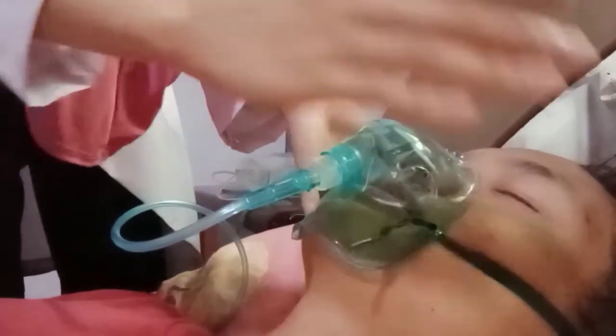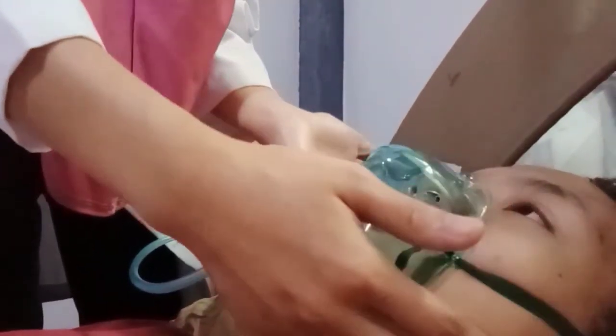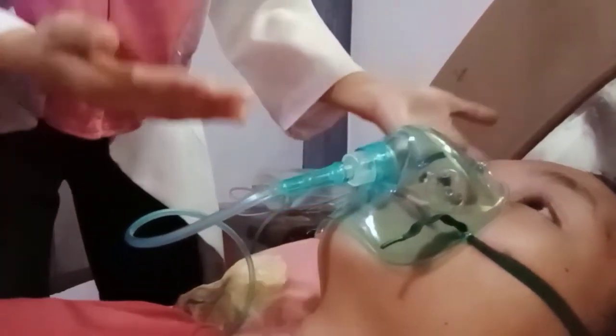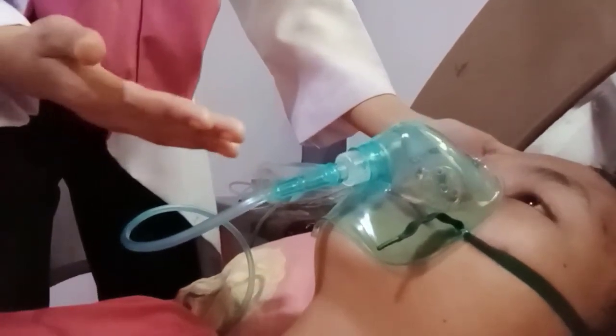Pads reduce irritation and pressure and protect the skin of the patient. You can either put in a pad or use a gauze pad under the elastic strap. This helps assess the effectiveness of oxygen therapy.